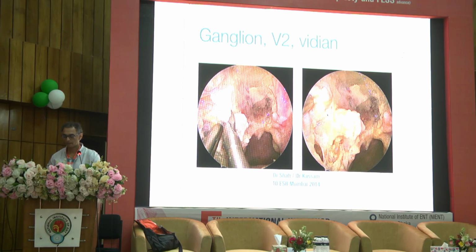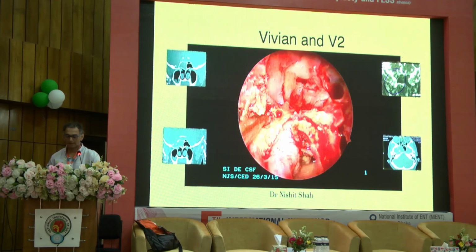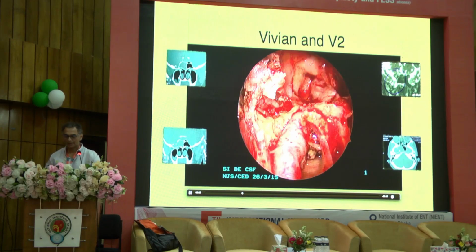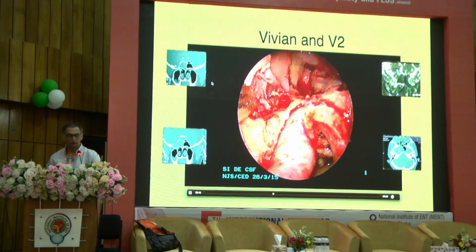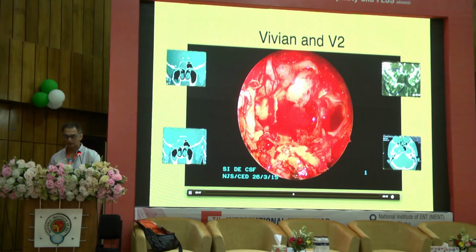Okay, so same thing here in a live surgery, CSF leak. You see we've drilled this whole area. So you have the Vidian nerve running across, and I have to go there to close this very lateral defect in a lateral sphenoid. So we do typically a transpterygoid, and you see above that is the Vidian canal, is the rotundum. So that's V2 running here.